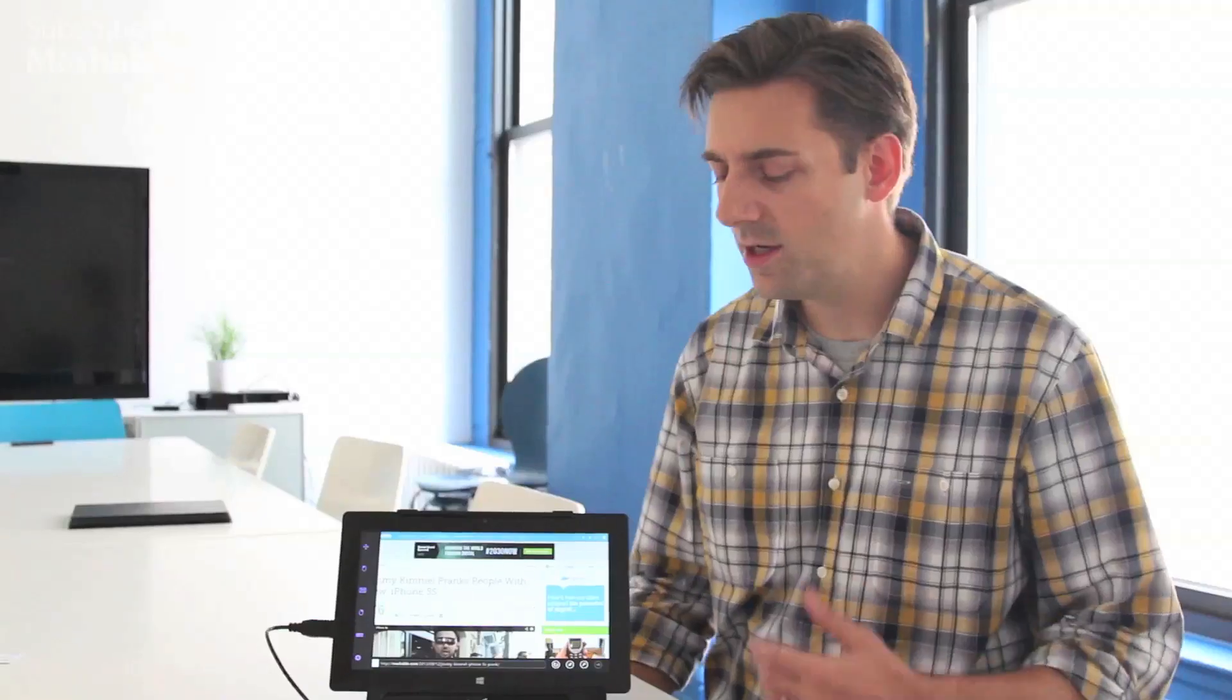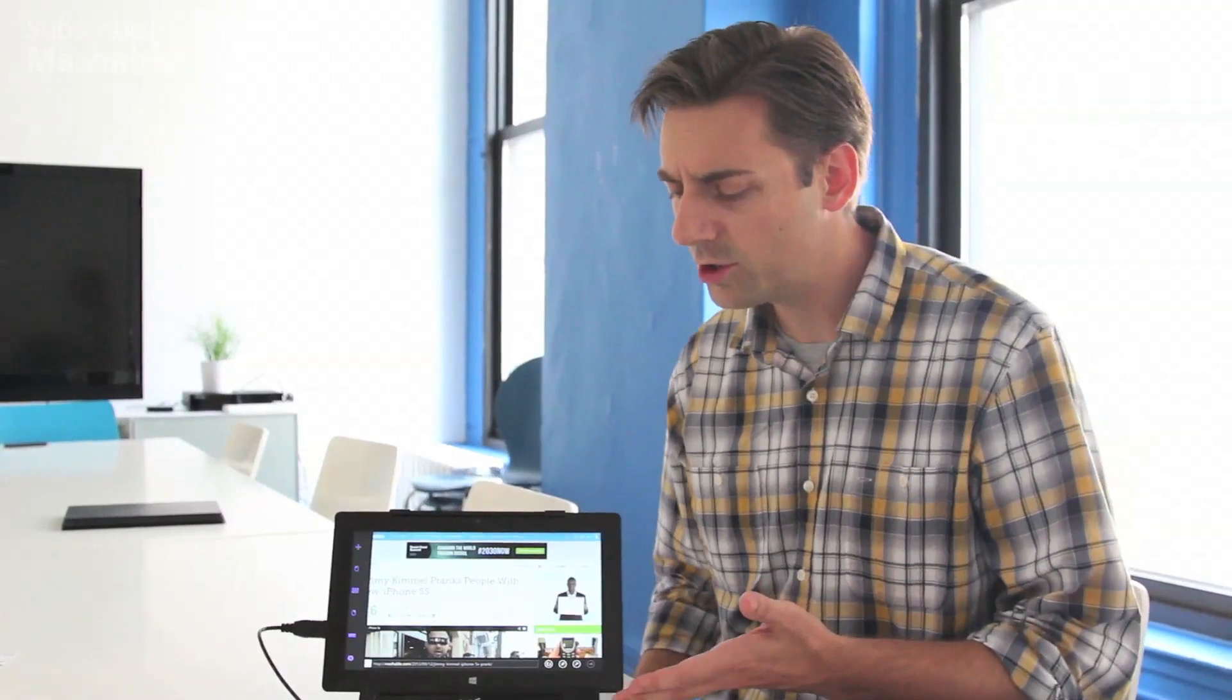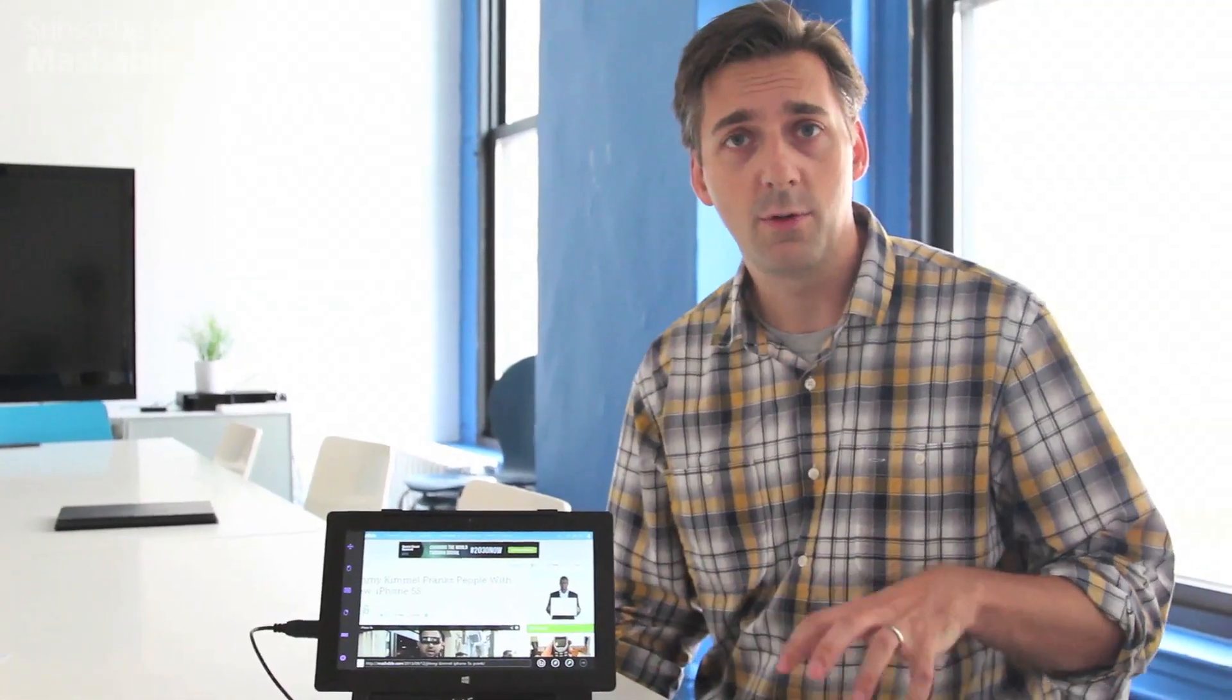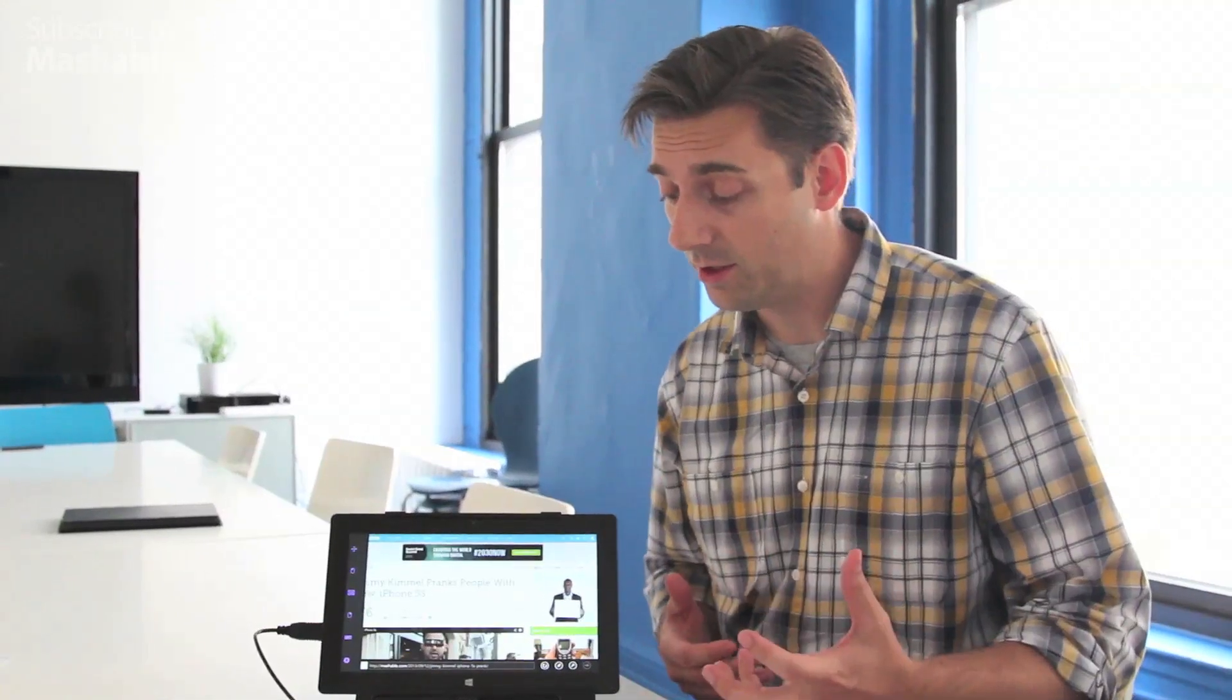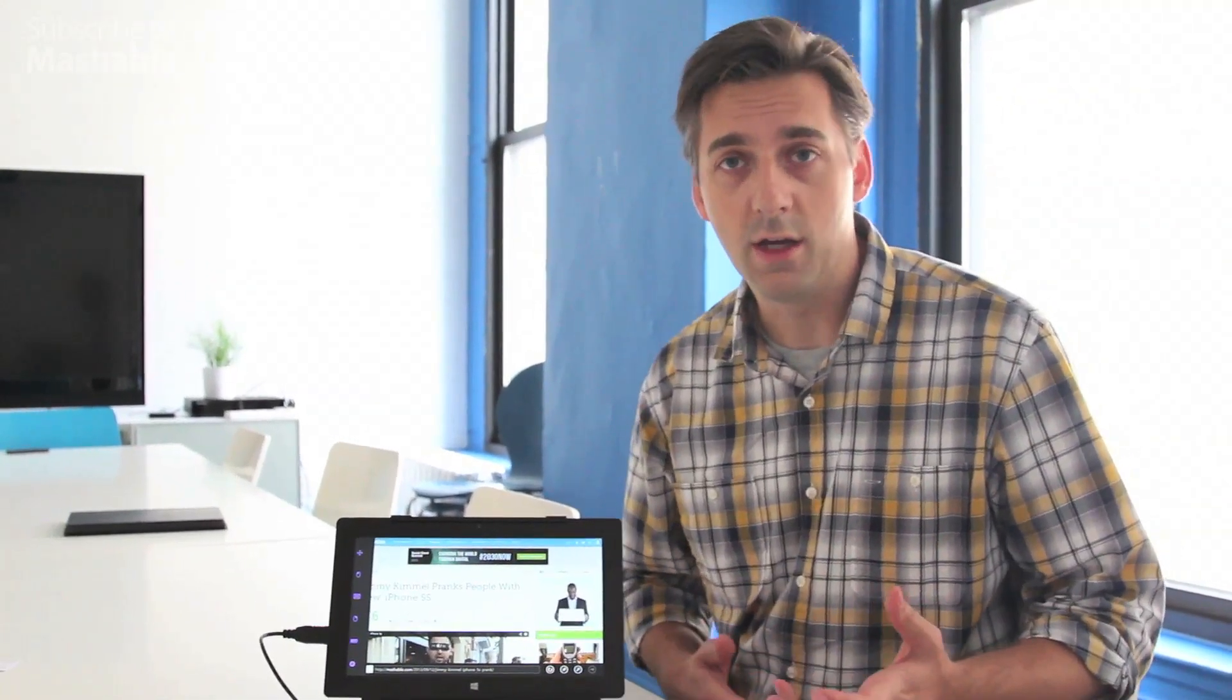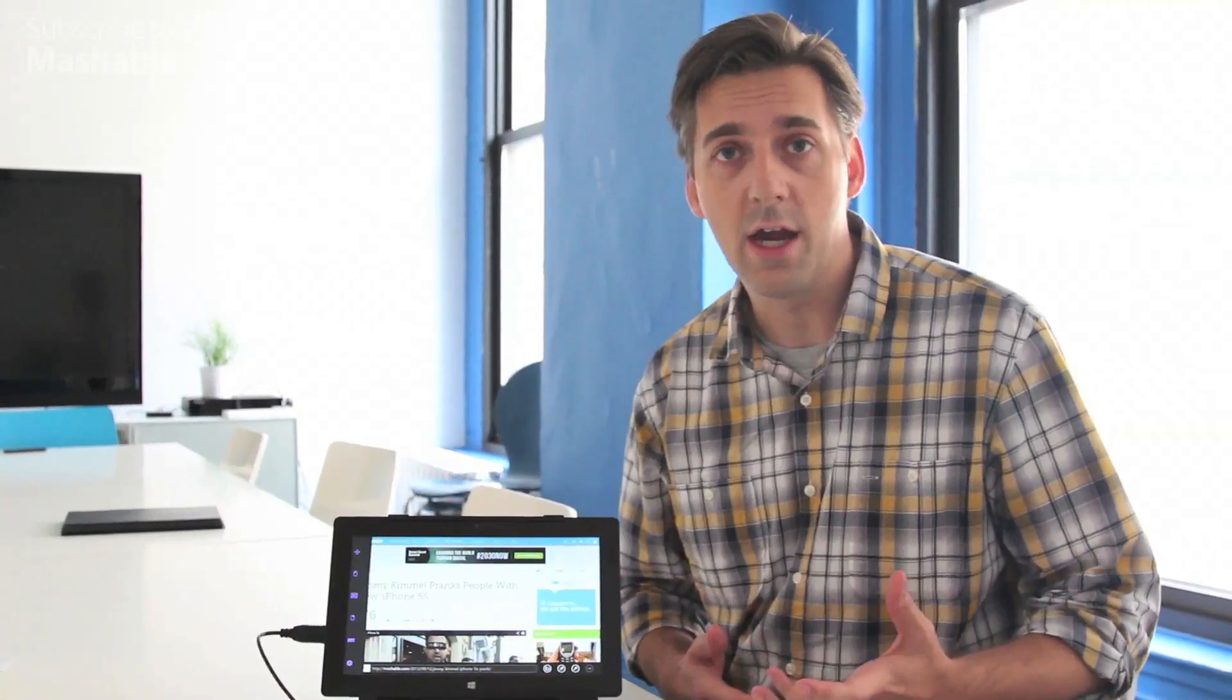This is Toby's eye tracking technology. Toby's been in this space for a while. This device specifically is for assistive technologies for people with disabilities. And it basically lets you control all of Windows 8, a Windows machine, with your eyes.